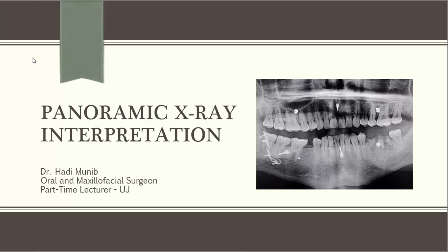Bismillahirrahmanirrahim. Today we're going to talk about a short lecture called Panoramic X-ray Interpretation: when to see and say this X-ray is diagnostic, and when to think there is an abnormality or not.